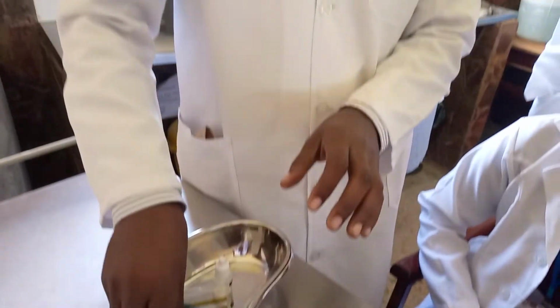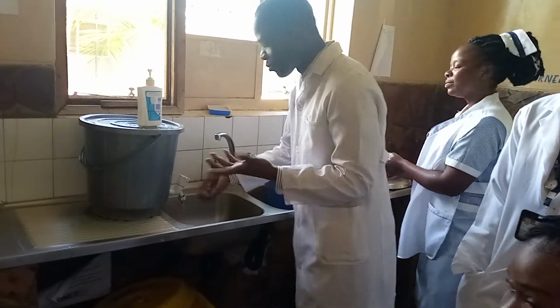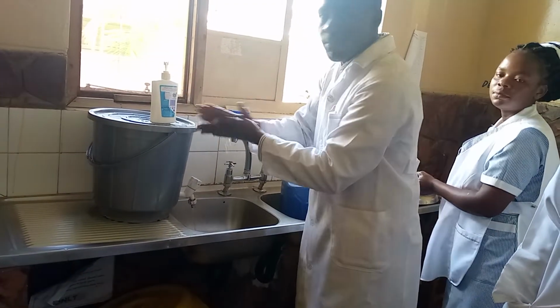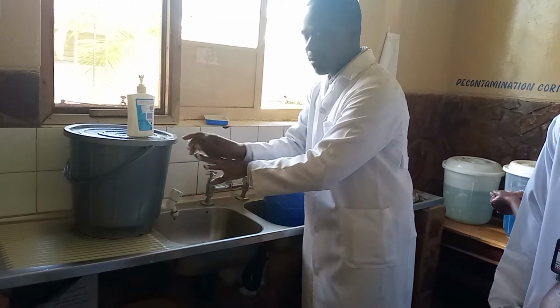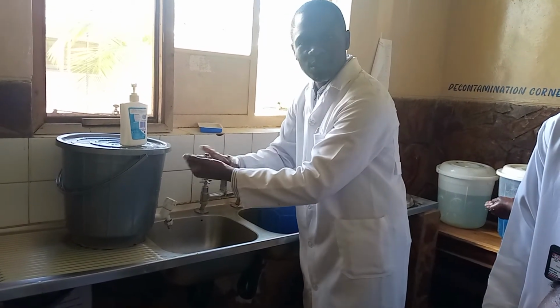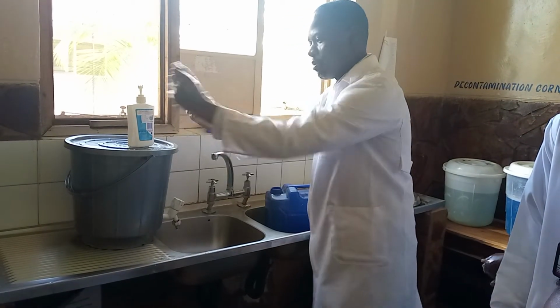Now before you start, since we are on the ward, this is not really OSCE. On the ward you have to go and wash your hands. So hand washing, as usual, goes with the 12 steps. That will be quick. Make lather, then that. Since we are dealing with a patient, you have to wash hands thoroughly.